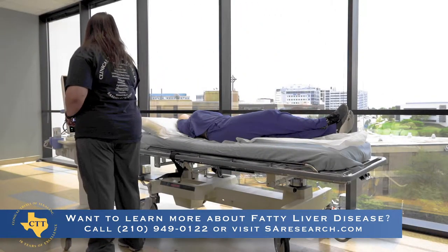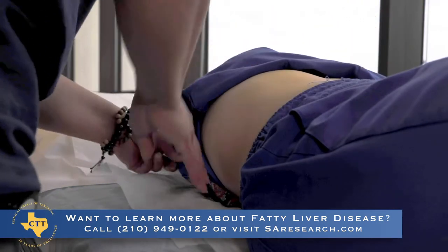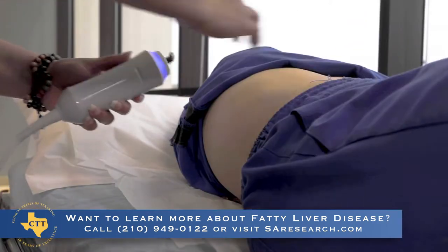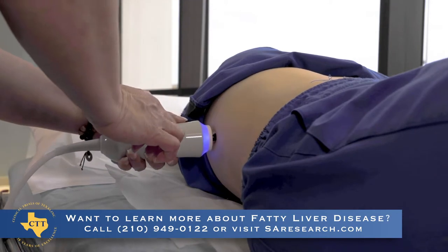It's not a picture of your liver. We're just doing this to see how non-elastic it might be. We want your liver nice and pliable, like what you see in the grocery store. This takes about 10 minutes and all we ask is that you come in fasting.